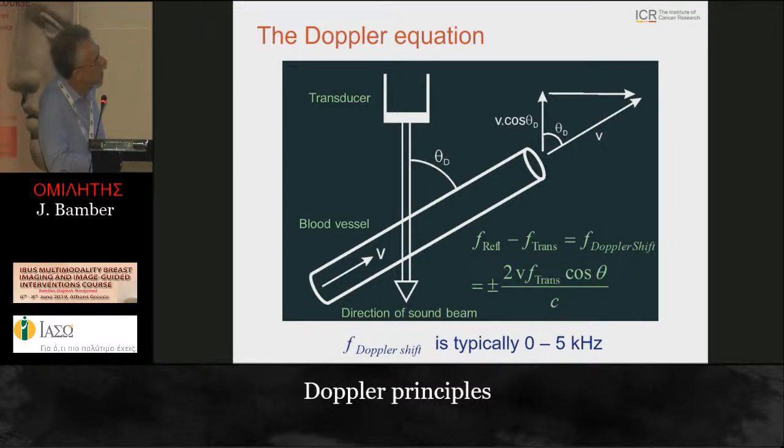You can steer the sound beam, the sort of steering that's used in the scanner for the compounding that we discussed earlier before the break, can be used here to steer the sound beam to make that angle smaller and make this a more favorable situation. So understanding, once again, a little bit of the physics can help you get a better result. And we'll talk a little bit more about that in the coming slides.